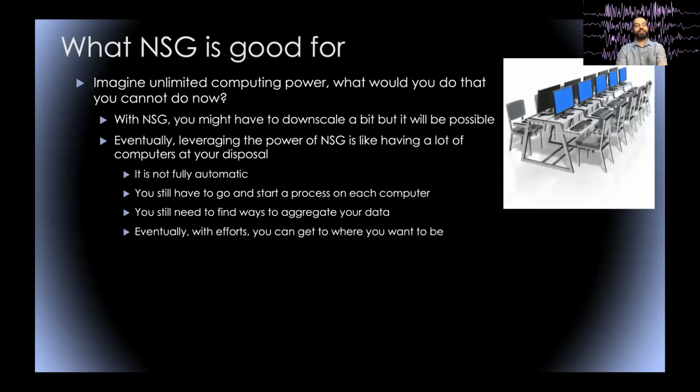So I like to give another analogy here. NSG is like you have a room of standard workstations. You still have to go to each workstation and start your process, so it's not fully automatic. And you still have to find some ways to aggregate your data once you start all these processes. But eventually, with effort, you imagine this array of computers, you can get where you want to be.